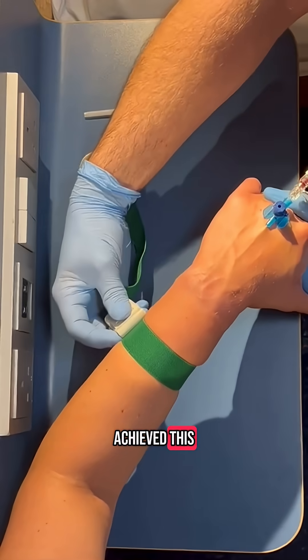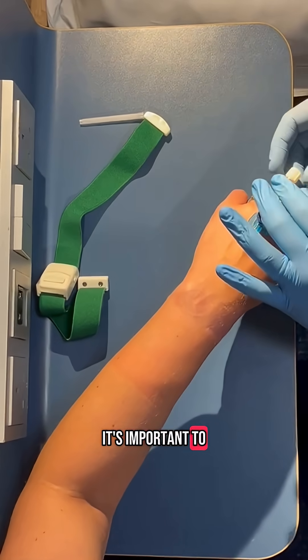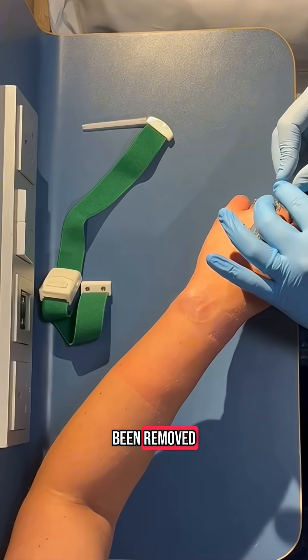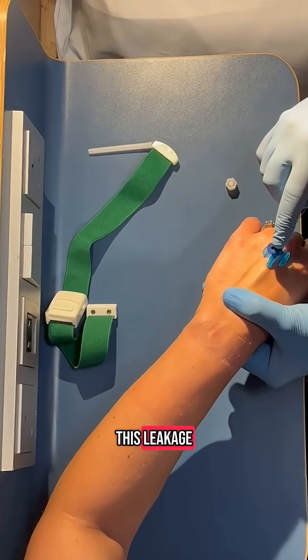Once you have achieved this, remove your tourniquet and prepare to remove your needle. It's important to remember that when your needle has been removed, blood may flow from the cannula, so you need to clamp it off to stop this leakage.